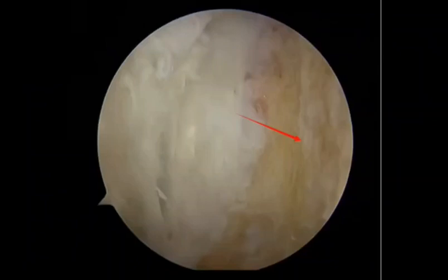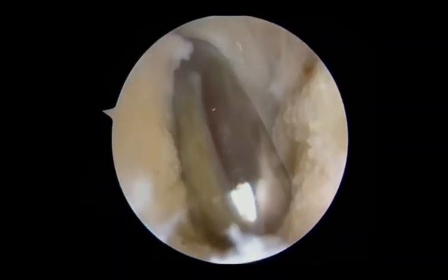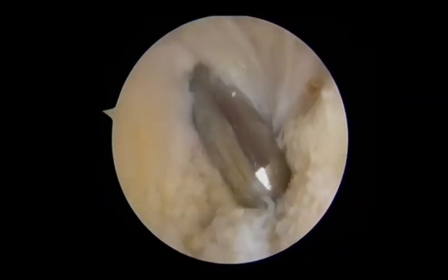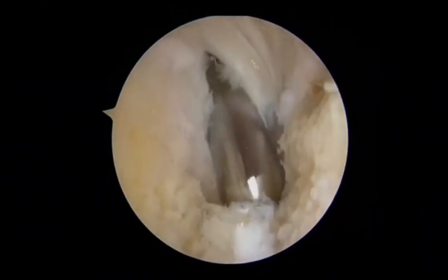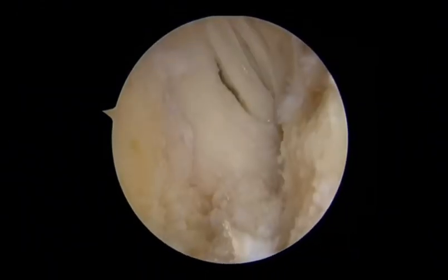The cleaning standard is that the protruding part of the tibial tubercle disappears and a slight depression remains. During this process, care must be taken to ensure that the cleaning reaches the proximal patellar tendon insertion. If it does, further cleaning should be stopped to avoid further damage to the patellar tendon insertion.